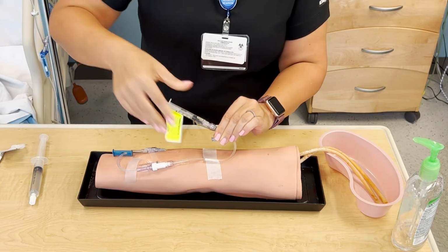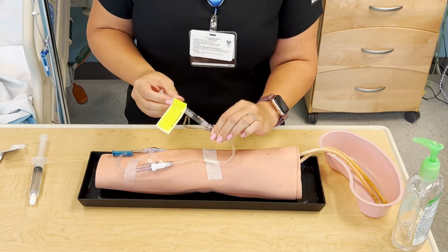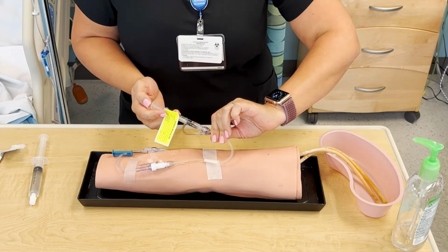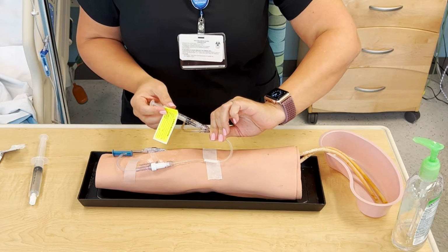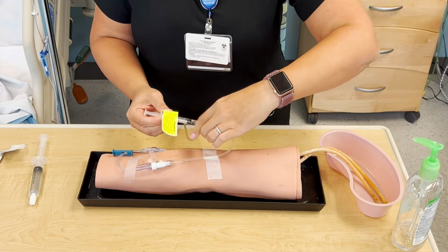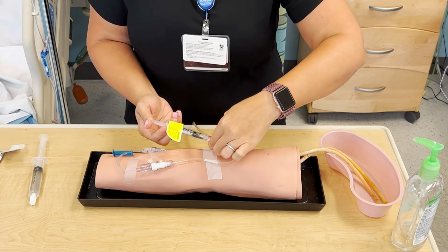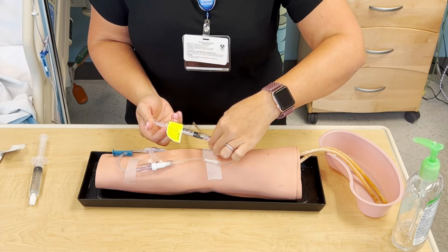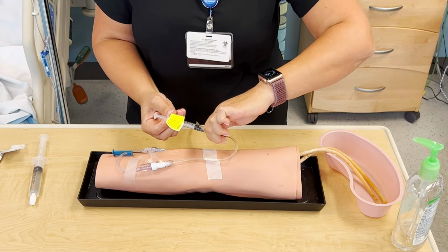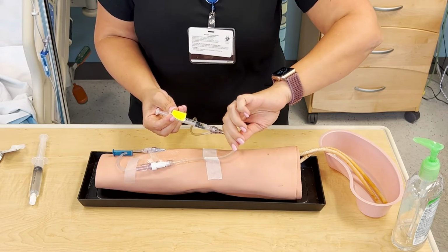And attach it. Making sure you can see the numbers. And we are going to give the medication in quarters, so 1/4 of it every 15 seconds. So go ahead and pinch. I'm giving 0.25 milliliters and then waiting for 15 seconds to elapse, and I can let that go while I wait.